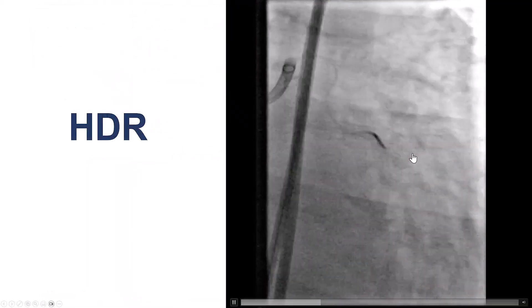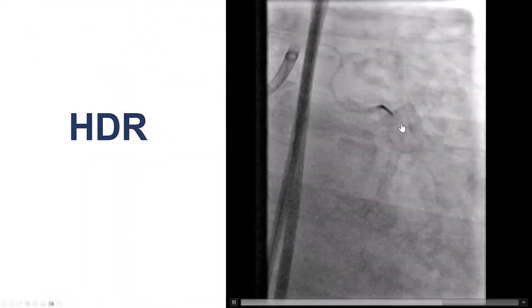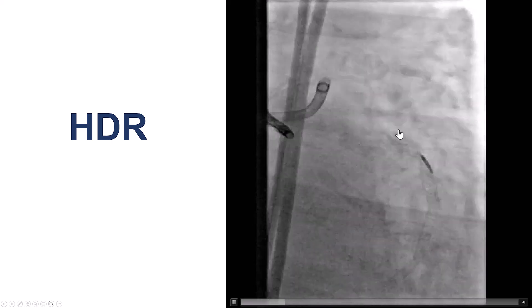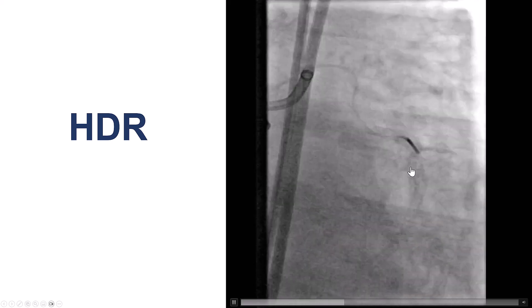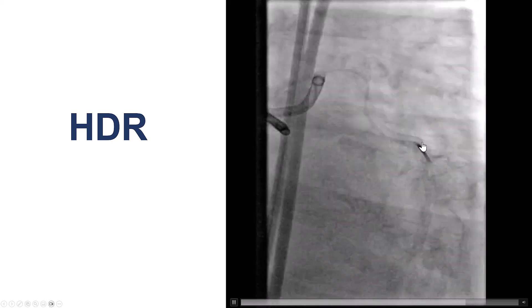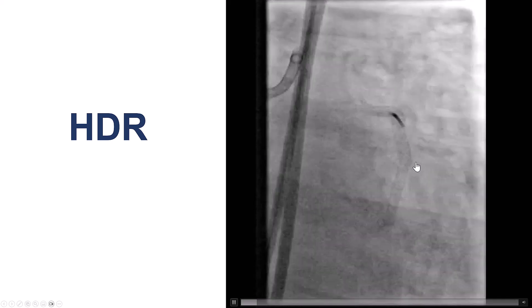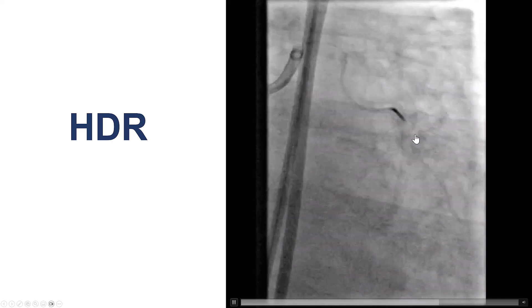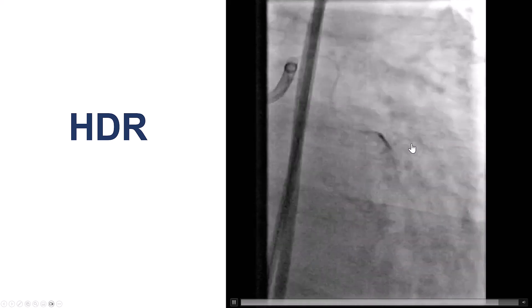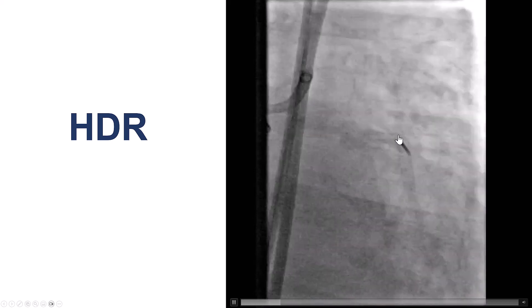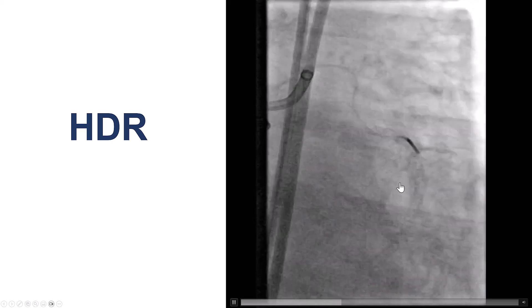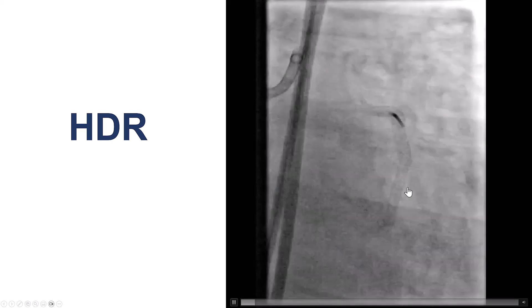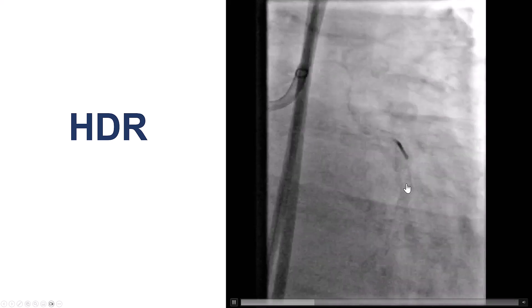We brought the microcatheter — the Turnpike — inside the previously placed stents, and then took the injection with a small amount of contrast, about 1 cc. We see not really much — there is a little bit of contrast staining inside, maybe going into one of the branches, but nothing major is happening.